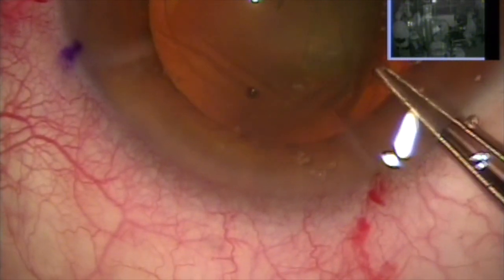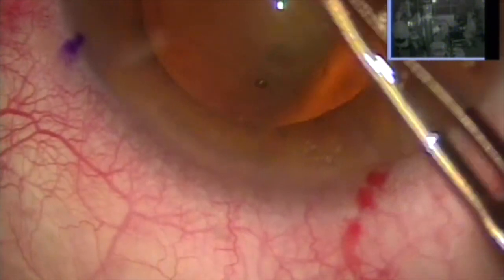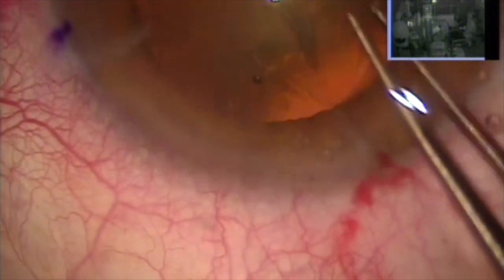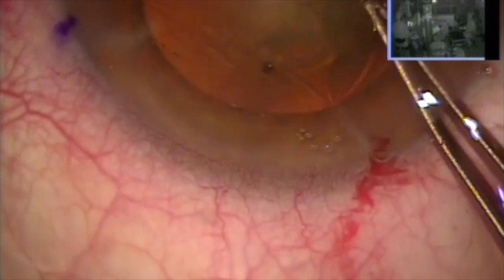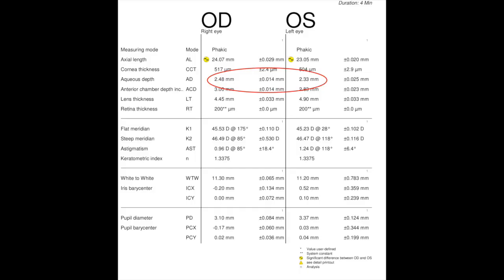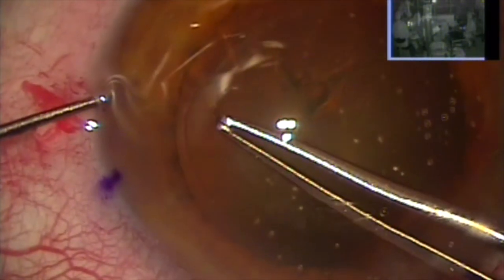Despite the fact that there's no phakodonesis — Greek word for shaking of the lens — we know that we have a very unstable capsule bag. And you can see also that I'm very careful, since that wrinkling does not give me stability of the peripheral capsule, to make the tear at a slower speed than I usually do. The right eye we're dealing with has a deeper chamber, also suggestive that the lens may be sitting more posteriorly than it should.